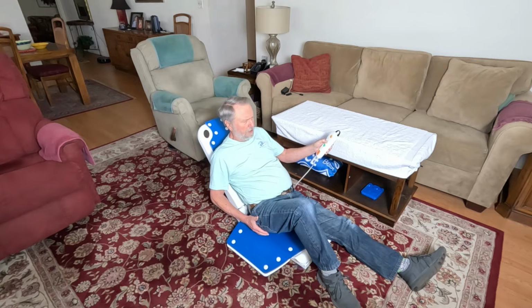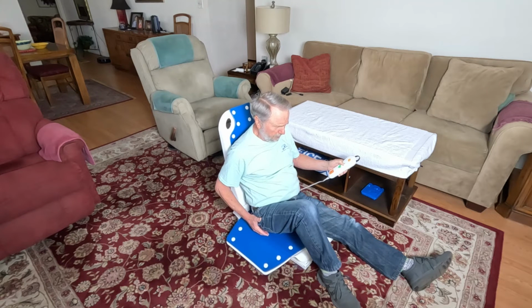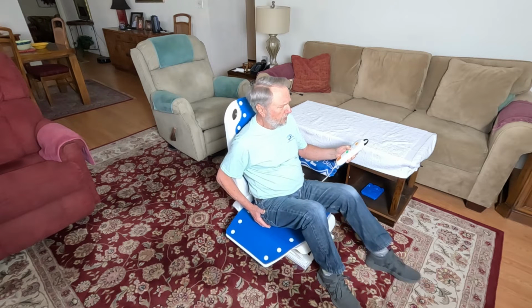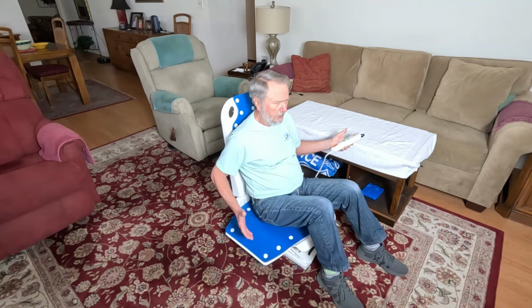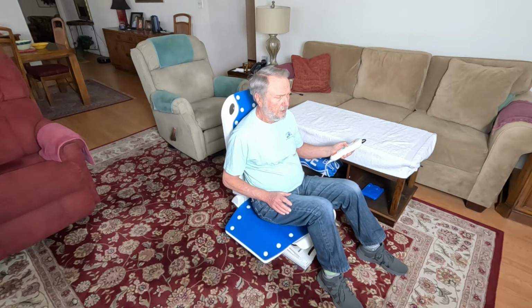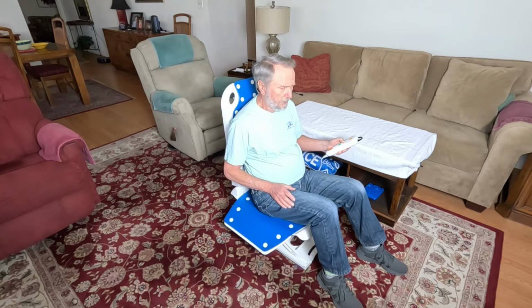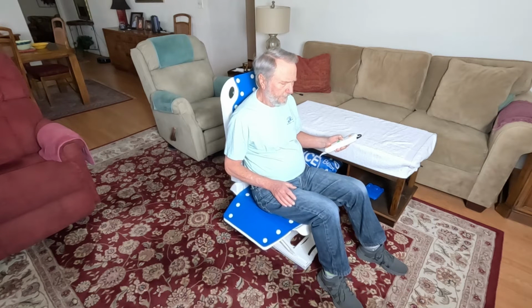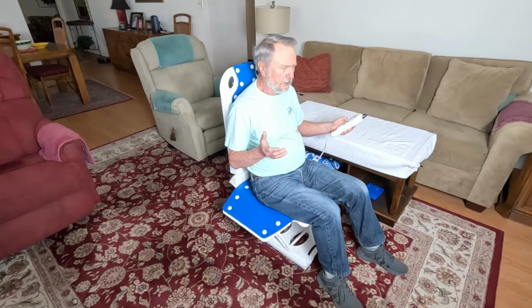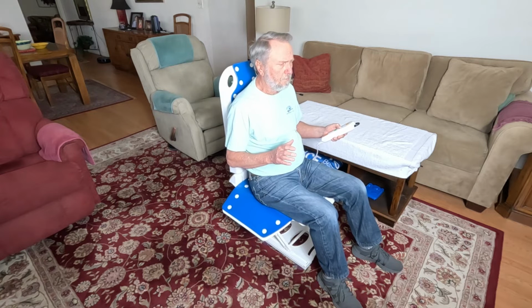I push the up button and hold it. The back is pulling me up to an upright. Now the seat is going up, and I need to hold this button. If I let go, it stops. So I could adjust myself, go back up, and I'm going to go all the way up as high as this will go. It goes at a nice comfortable speed, and again I can stop if I need to and situate or rest, whatever.